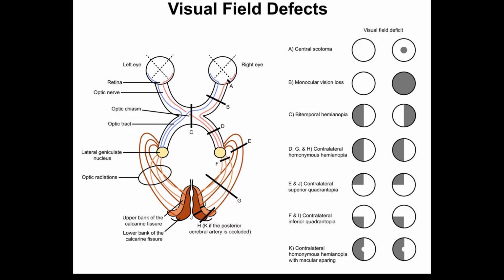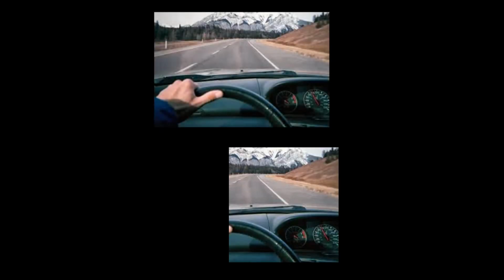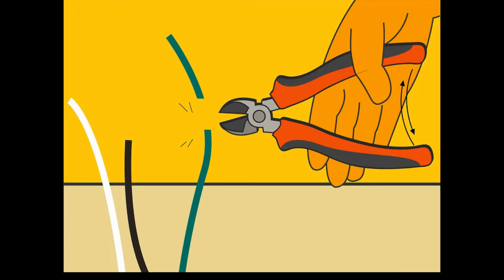True visual field loss is the result of damage to the neural pathways between the eyes and the visual cortex. This type of field loss is often a complete loss of vision to one side. Fortunately, it usually spares the macular region, so they may still have 20/20 acuity. When stroke or trauma causes damage to the visual pathways, the nerve fibers that leave the eye cannot conduct the electrical signals to the visual cortex.